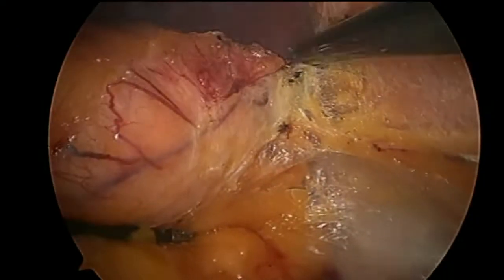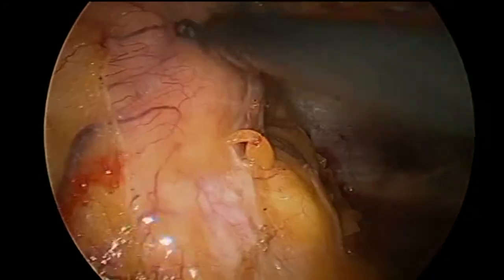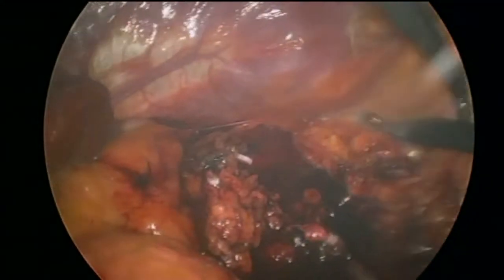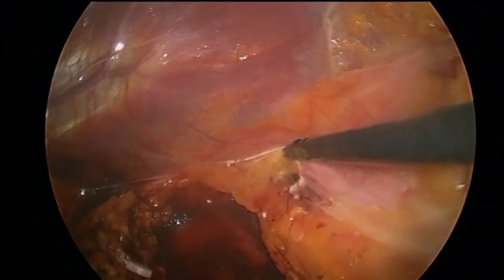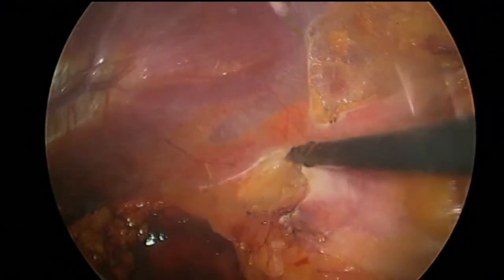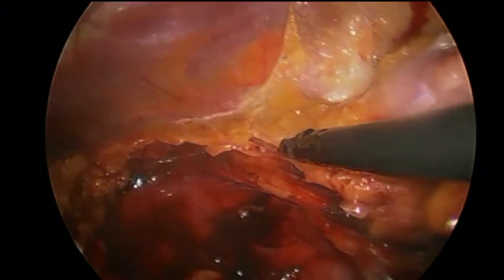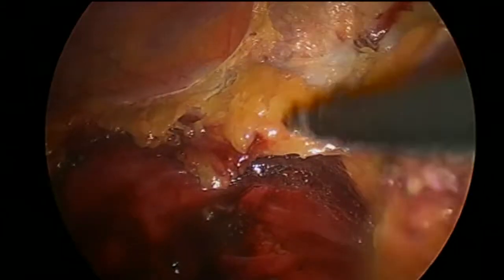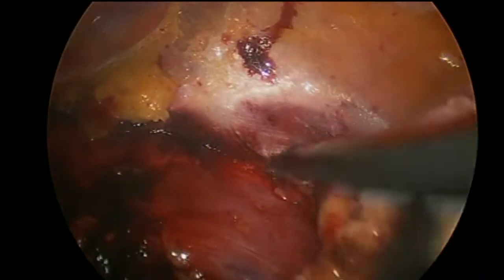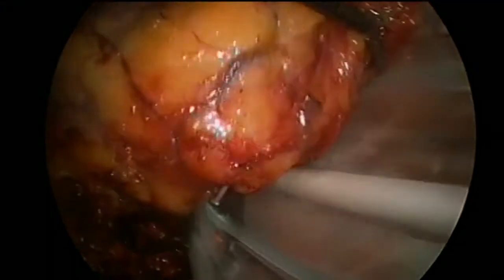I seem to find those vessels unerringly and make them bleed every time. With the diathermy on high, you can get it done fairly quickly and efficiently. You can use high diathermy settings around here because it's away from the bowel or vessels. Once it's completed, make sure the kidney is definitely free. The last thing you want to do is try and bag it and then rip a small artery off, because that can cause significant bleeding. This is just cutting the last bit of the peritoneum. Always have good traction and find the areolar tissue plane. Understanding the embryology of the retroperitoneum is actually the key to understanding all these layers — understanding the entire retroperitoneum and the physiological hernia and how all the structures got stuck down actually explains all these planes to you very clearly.